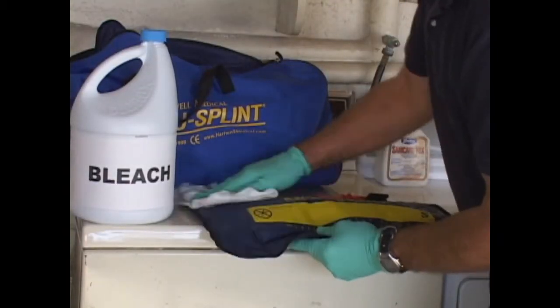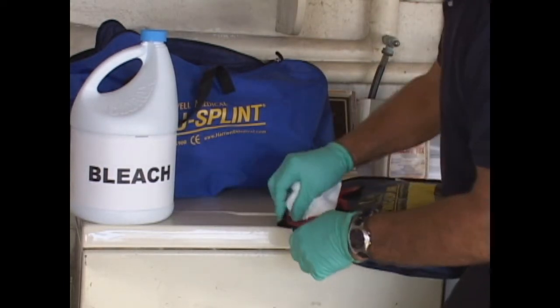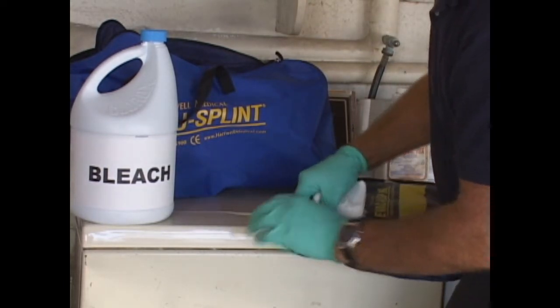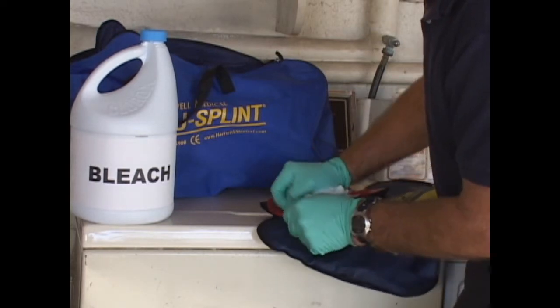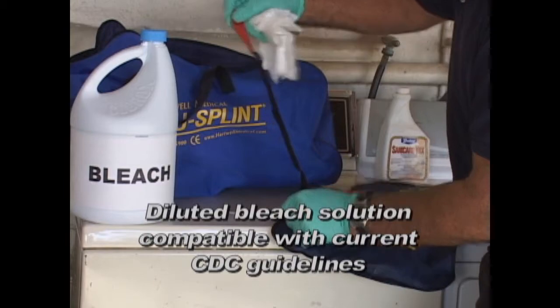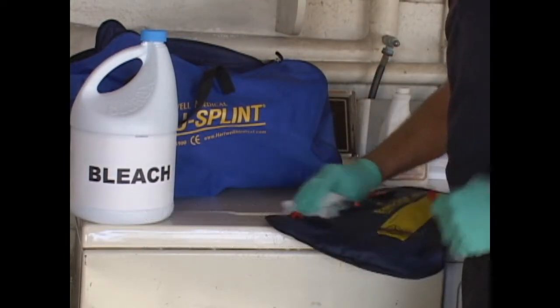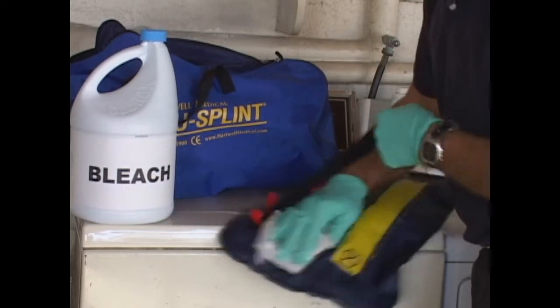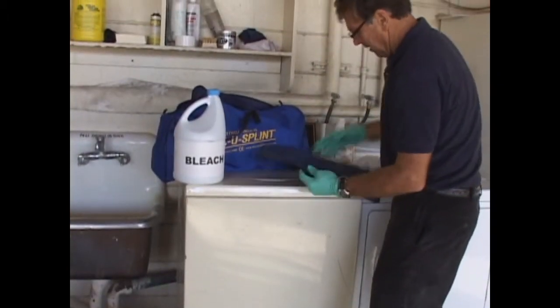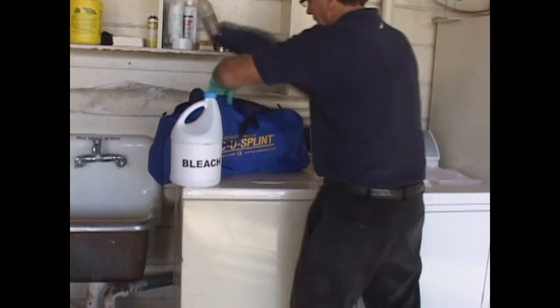Sodium hypochlorite, that is bleach solutions, may be used, but avoid prolonged exposure of the fabric to high concentrations of bleach because discoloration is possible. Bleach solution can be used on the EVAC-U-SPLINT, but it should be thoroughly rinsed off with lukewarm or cold water and then allowed to dry. Make sure the splint and splint straps are completely dry before placing them back into their storage and carry case.